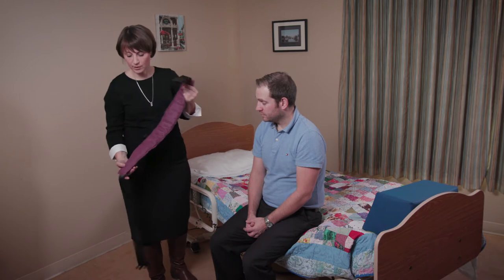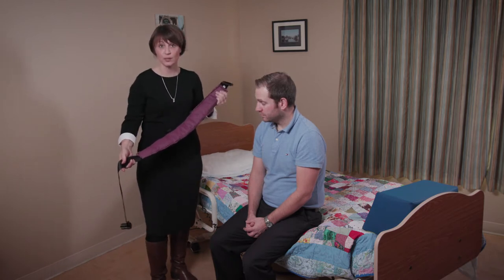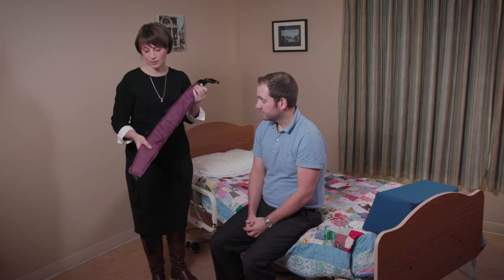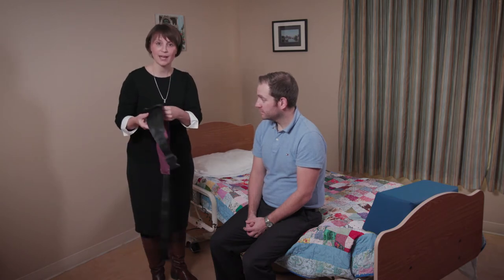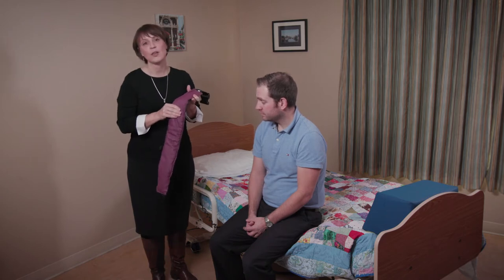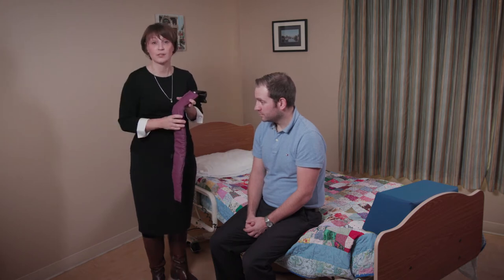This is a transfer belt, and in particular this belt is called the Ruth Belt. It was made by a lady called Ruth. The benefits of this belt are that you can see there's some padding in there so it's quite comfortable, and it also has a grip material that allows it to grip to the sides of the client and to their clothes, and doesn't ride up onto somebody's body and up to their arms.